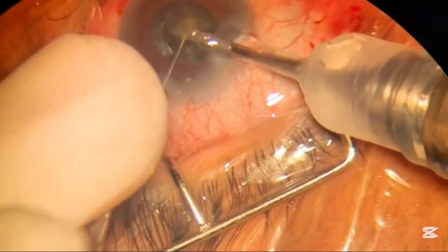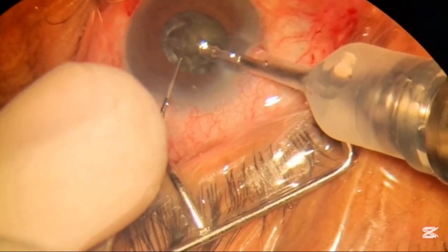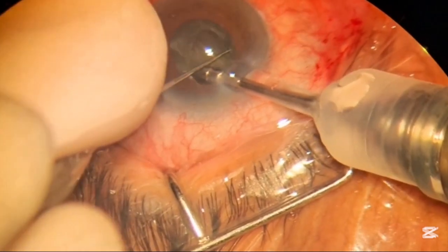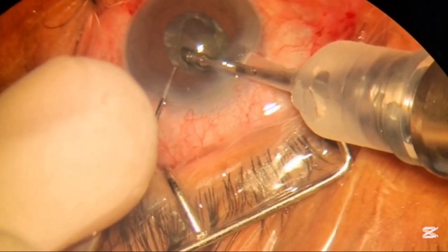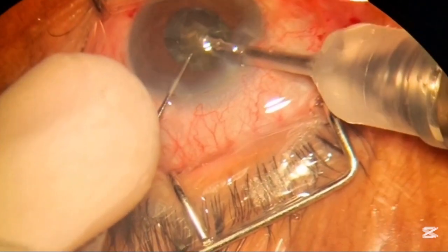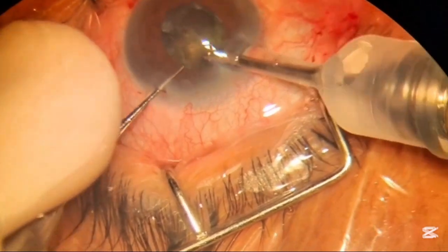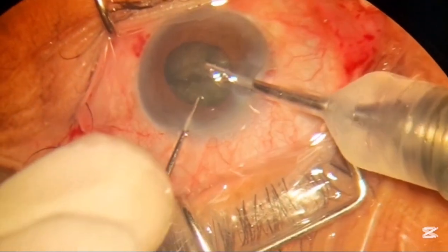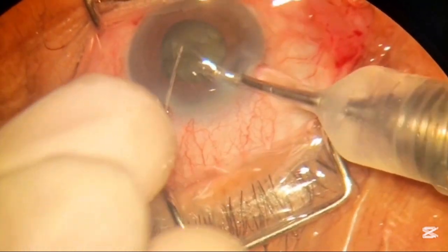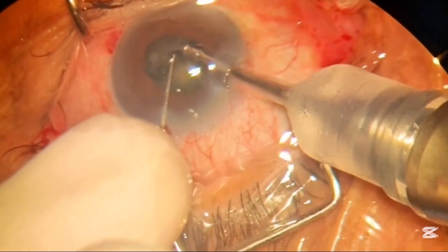Do remember never remove all the pieces before you are done with the total chopping of the nuclear material. If some big part is left in the bag it will be difficult to chop at the end, and it will be unsafe as the capsular bag will be exposed to higher FACO dynamic pressures. You have to chop bigger pieces which can touch the posterior capsule and cause complications.